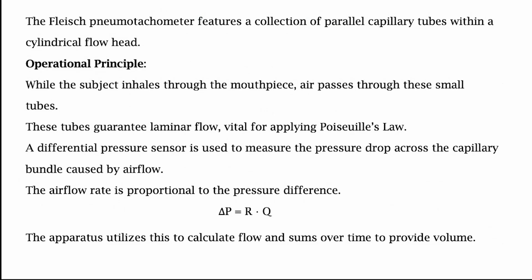So laminar flow is that whereby by having several small tubes, you are essentially limiting the Reynolds number to a relatively small value and ensuring laminar flow. That does not mean, as I previously said, that if you have small tubes, you will necessarily always have laminar flow. That is not true always. If the radius becomes too small, then wall effects and other such things will come into the picture. It doesn't mean that there will be no turbulence, but this is a way in which you could approach this problem.